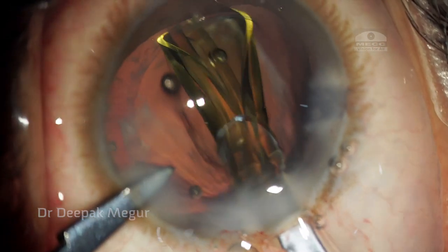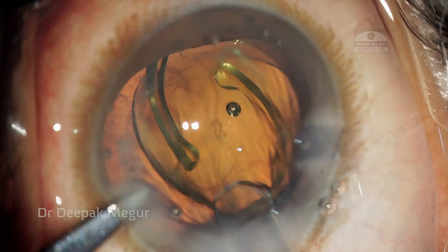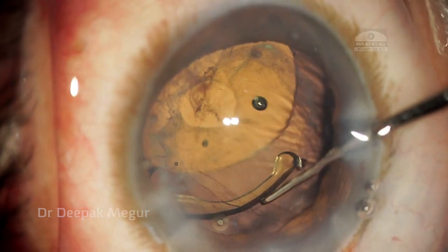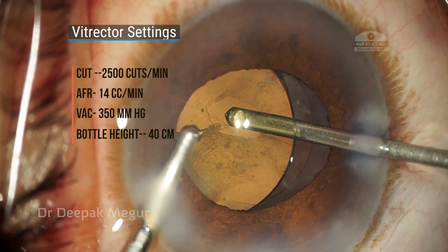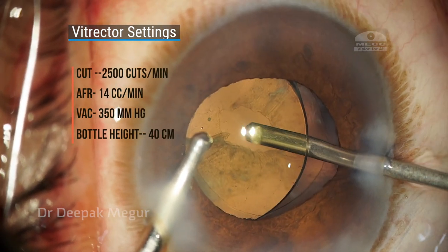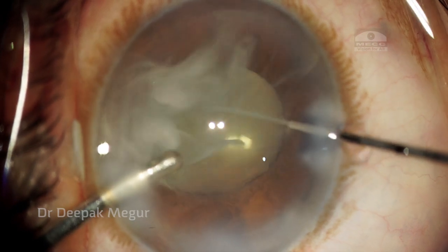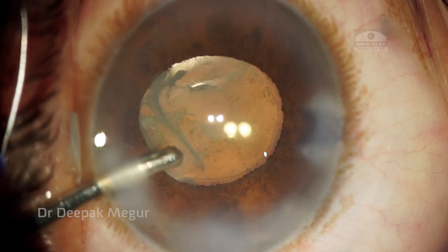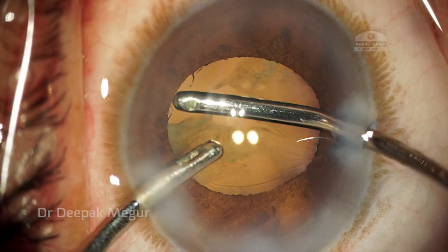I am implanting the foldable lens into the bag. After gently nudging the lens into the bag, I need to remove the OVD which has gone behind the IOL, so I am going to use my irrigating handpiece to remove it. An important point to note here is the bottle height is at just 40 cm — this is the key, because we don't want sudden deepening of the chamber or a lot of fluid going into the posterior chamber beyond the posterior capsular tear. That is the reason why we can maintain and prevent the anterior hyaloid face from rupturing, as demonstrated by the lack of any vitreous prolapse after using Triamcinolone Acetonide.